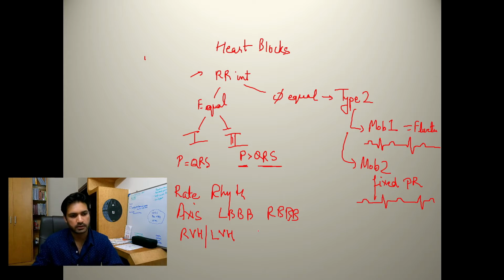So what I wanted to do is just give you a simple overview about the most common things which are asked. One thing which is left is MI, and I just want to quickly cover that. Just give you a superficial, broad picture of what findings you can find on an ECG related to an MI, and after that we're done.